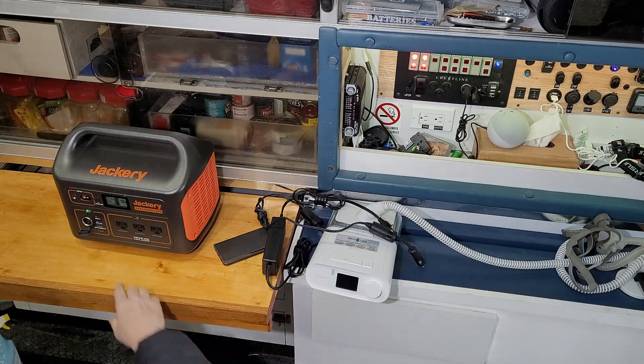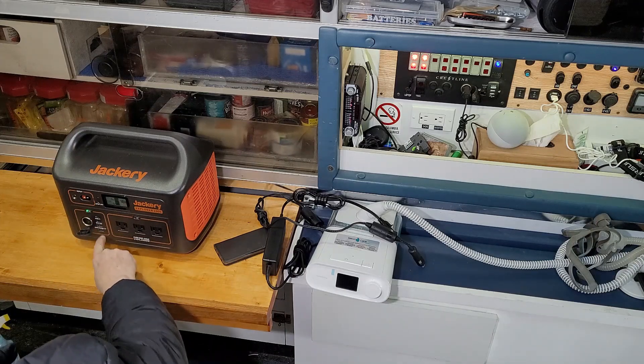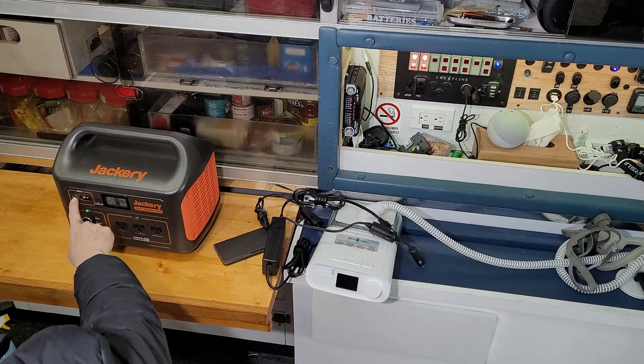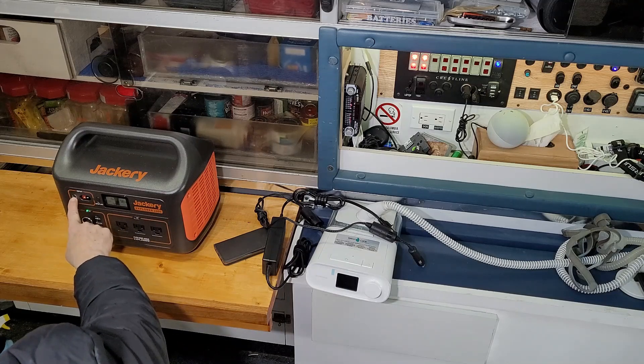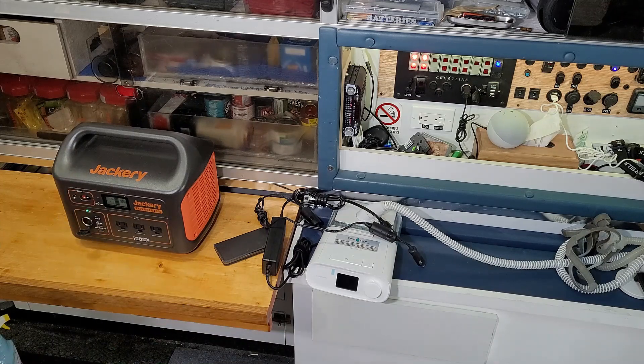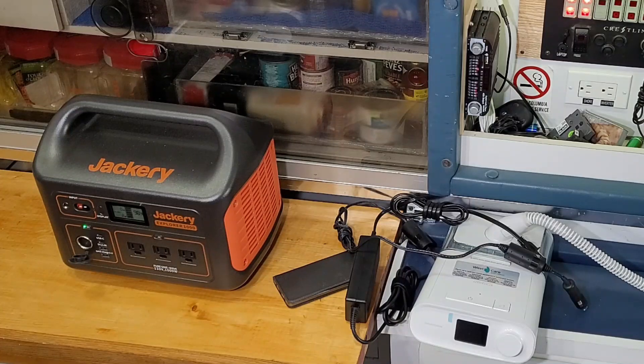I really like the Jackery 1000 — I was quite impressed by the build. It's got the 12-volt outlet, USB-C outlets, 2 USB outlets, 3 110-volt outlets, an input for your AC charger or vehicle charger, and your solar input charger. This is definitely one thing I want to get on my wish list — maybe not the 1000, but the 500 for emergency cases. I'm really happy with the quality and performance, so I definitely recommend it.